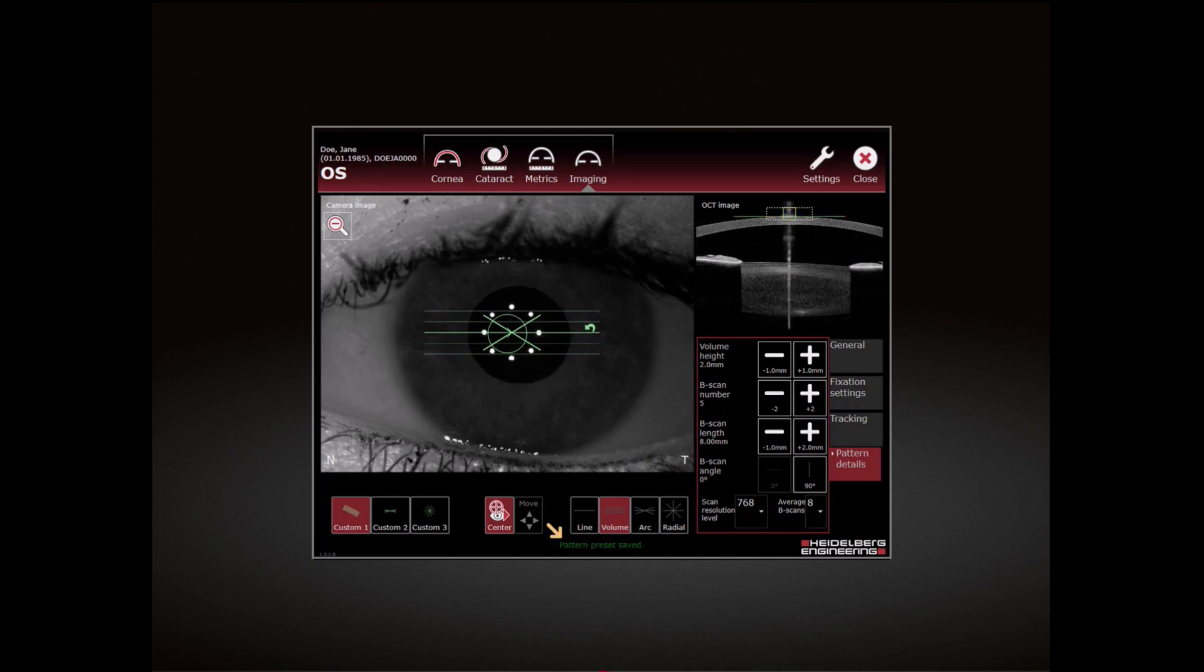A message is displayed at the bottom of the acquisition window indicating that the pattern preset has been saved. To overwrite a preset, repeat the saving procedure.